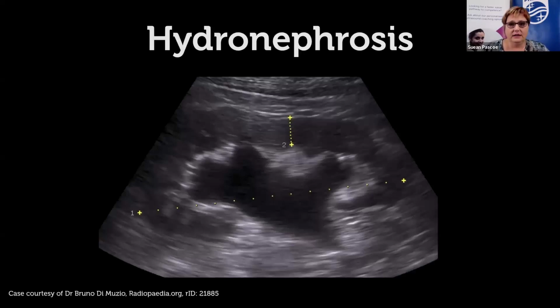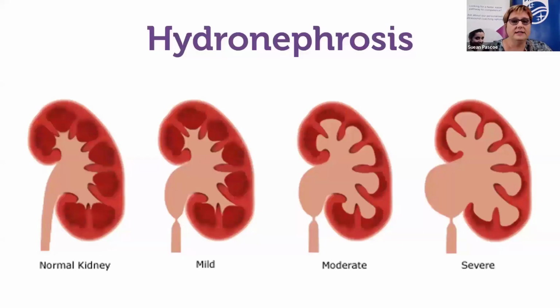So like I said, in my clinical practice, I've always just examined the bladder first, got the patient to pee, come back and then examine the kidneys so that we can determine whether it's true hydronephrosis or just separation because of over distension. Now there's degrees of hydronephrosis, and in the radiology reports, they kind of call it mild, moderate and severe, or mild, moderate and marked. And it depends on the degree of pelvic calyceal involvement, how you would describe this.